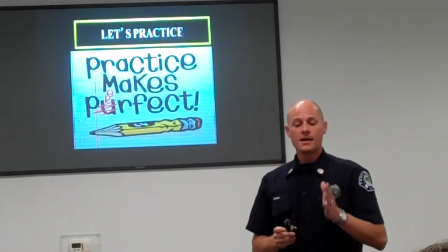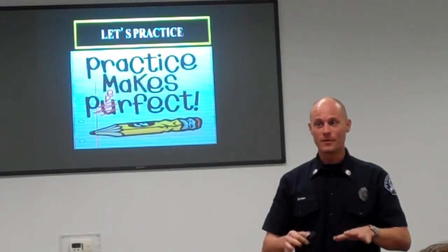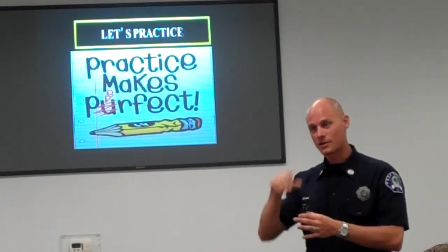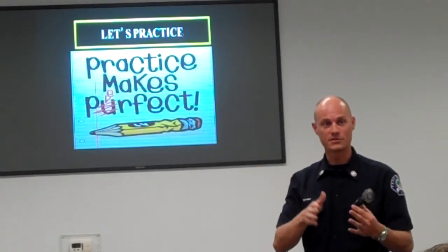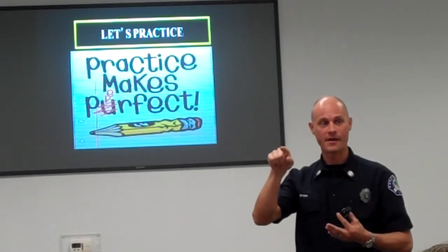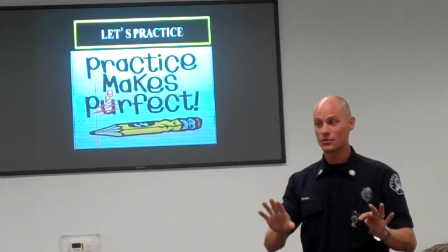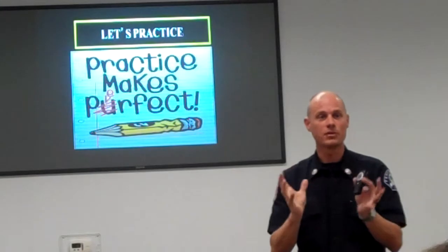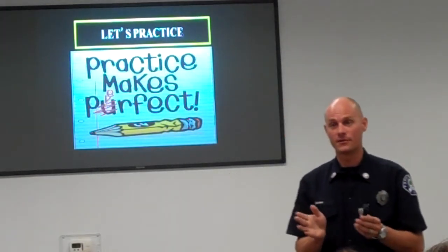That's it. The way that I personally do this, feel free to do it how you guys want to, but personally this is the easiest way for me, and the reason I do it this way is because on a quick look, you can quickly see it this way. So I always start my 12 lead interpretation with leads 2, 3, and AVF. I always look at that first, okay? The reason I do that is it's standard 4 lead, quick look, you can look at that just real quick and say 2, 3, and AVF, I saw the complete inferior portion of the heart. So 2, 3, and AVF, I look there.